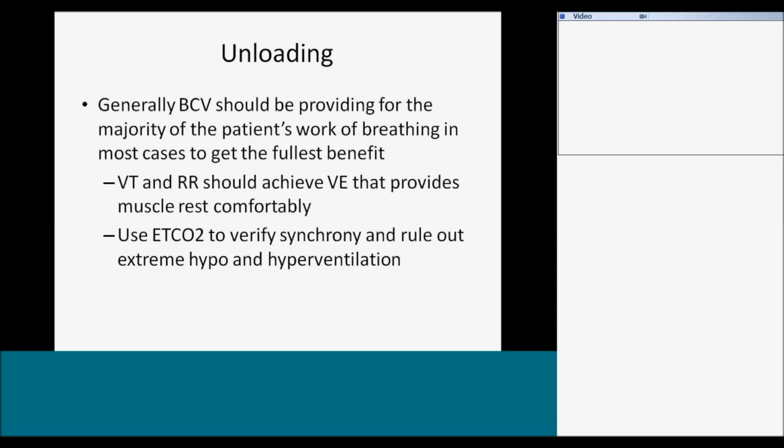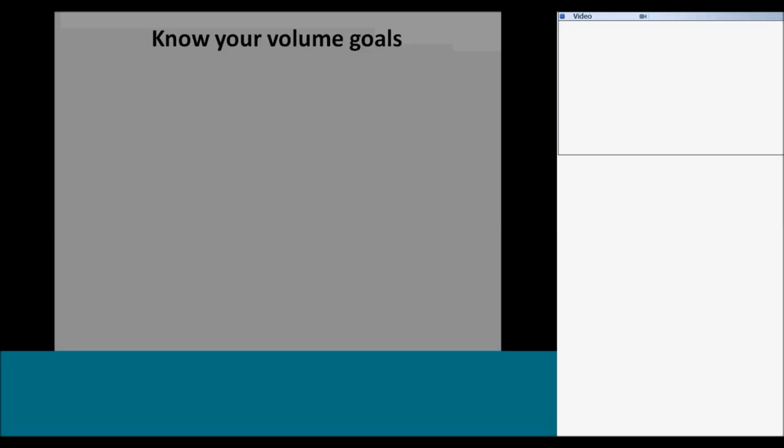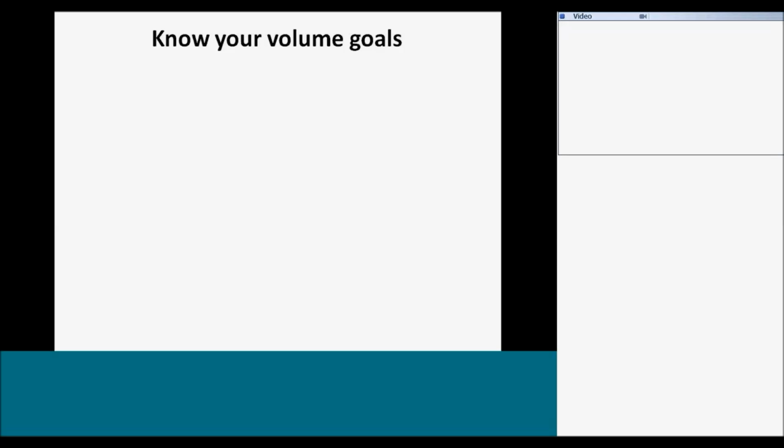All we're using end-tidal CO2 for is not a real specific or exact value for many of these patients, particularly when measured through a mask. But we want to make sure that we're not driving their CO2 way down, or allowing their CO2 to run really high and hypoventilating them. So we're looking for a pretty broad ballpark range, and we'll see those values when we get to it.